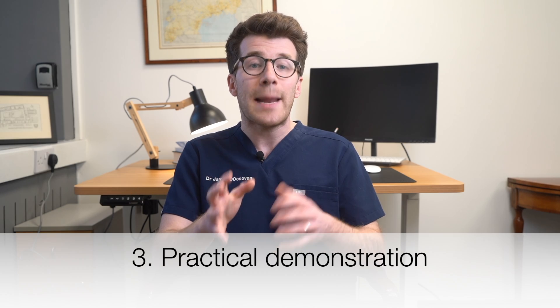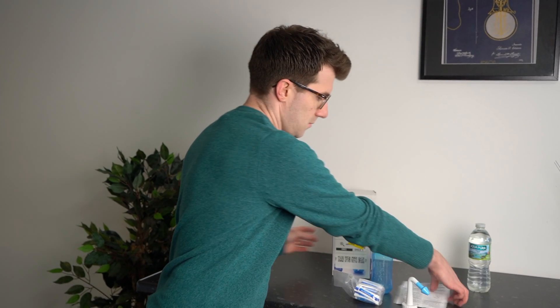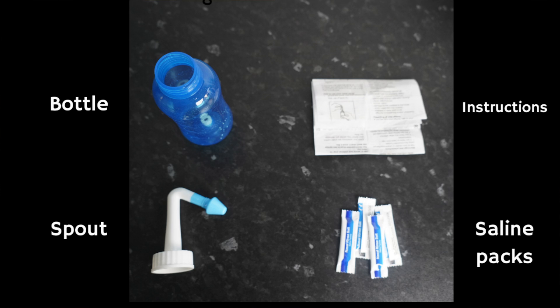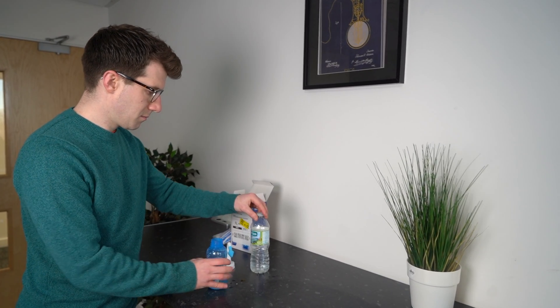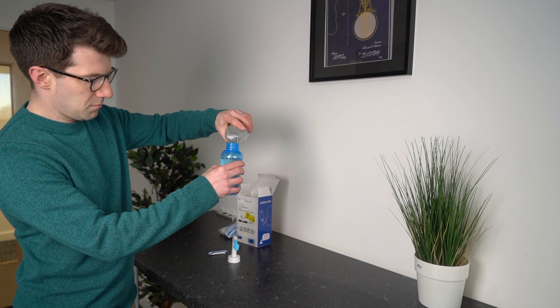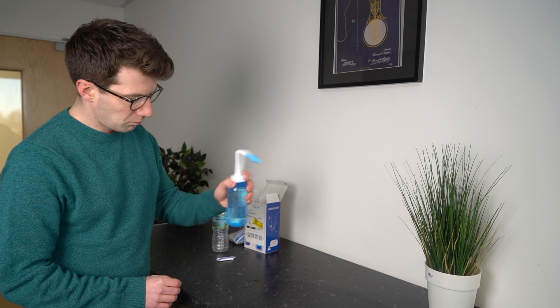Now let's take a look at a practical demonstration. First, take the kit out of the box and read the information leaflet. You should have the saline rinse solution packets, an instruction leaflet, and the rinse bottle as well as spout in the box. Read the instructions fully before starting. Next, add the saline solution to a clean dry bottle, then add clean sterile water. Tighten the bottle top and shake it a few times to make sure the rinse solution is fully dissolved.